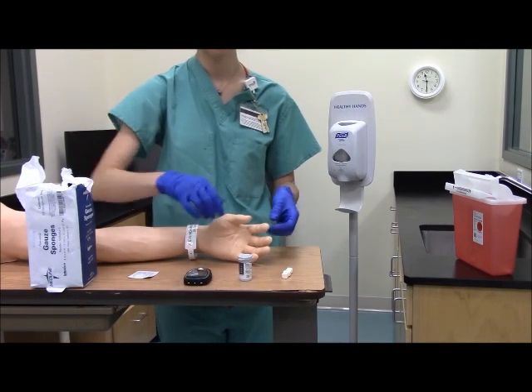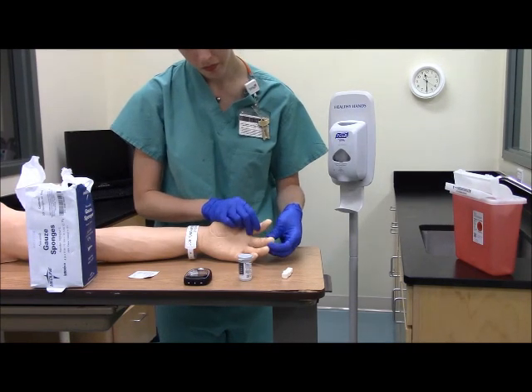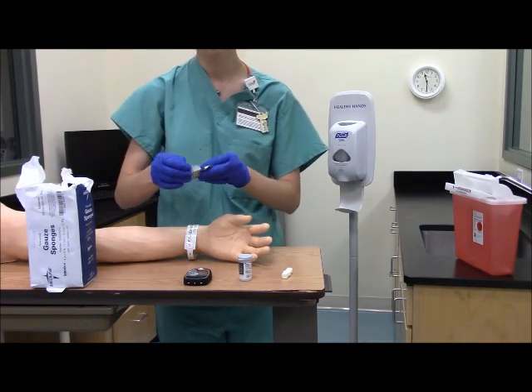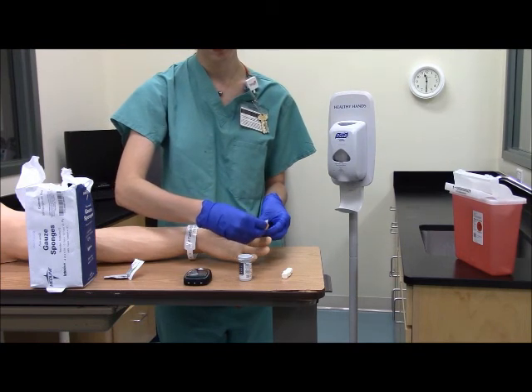Now you want to choose a skin site free of lesions and calluses. Make sure there's no edema and that the site is warm. You want to cleanse the skin with an alcohol swipe. It's very important to allow the skin to dry completely.